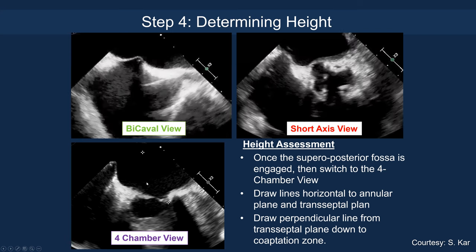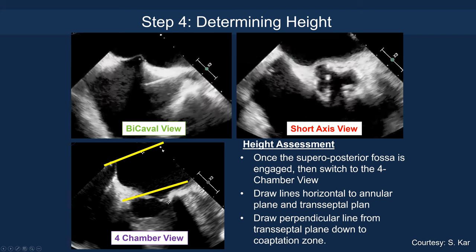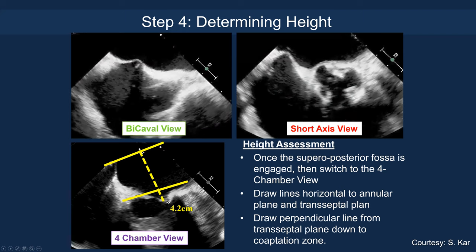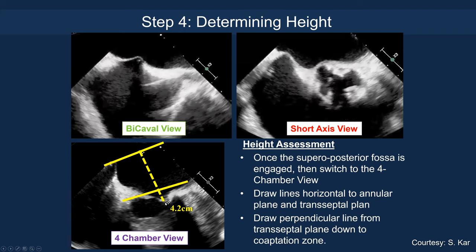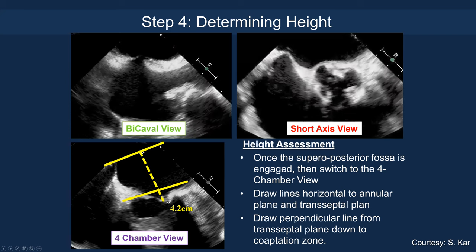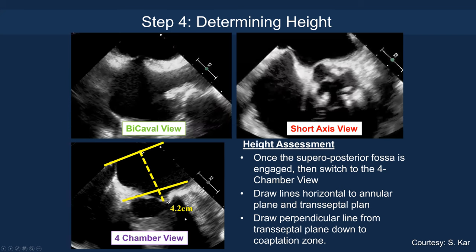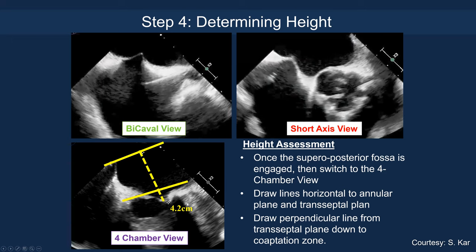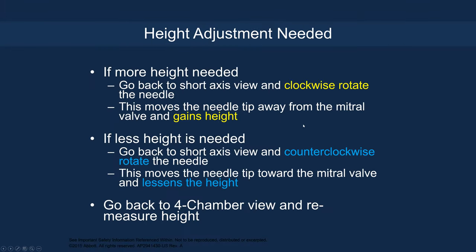On the four-chamber view, you see the tenting and can measure perpendicular to the mitral annulus. You must measure in a perpendicular manner rather than oblique, as an oblique measurement will overestimate the actual transeptal height. If you need more height, go back to the short-axis view and clockwise rotate the needle and system to rotate the catheter posteriorly away from the mitral and aortic valve to gain height. If you need to lose height, counter-clock the needle to reduce height, then remeasure on the four-chamber view.